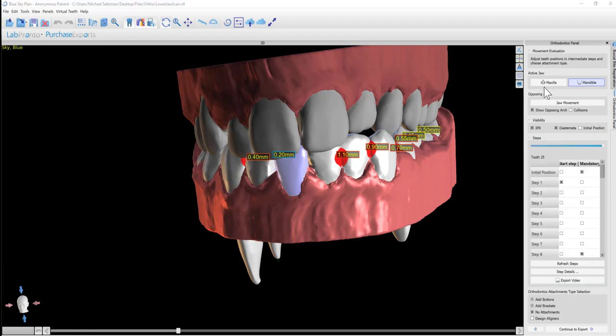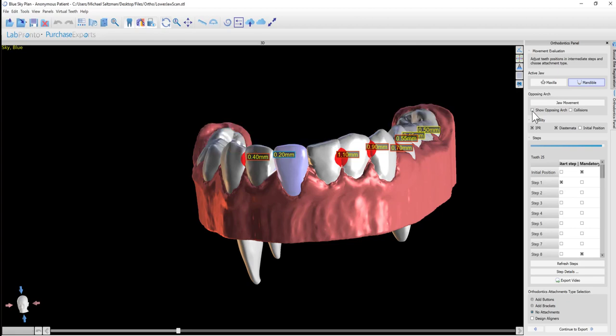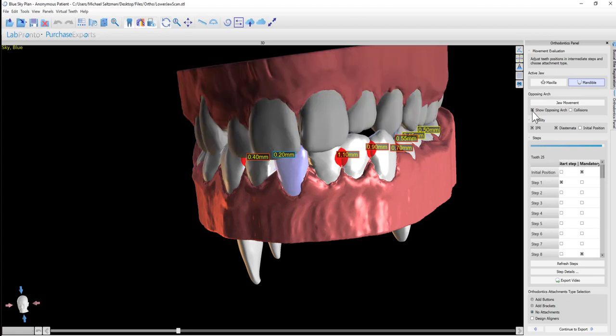So this panel, like our other panels, have the option to view the maxilla, the mandible, or we could have show opposing arch selected that shows us both at the same time.